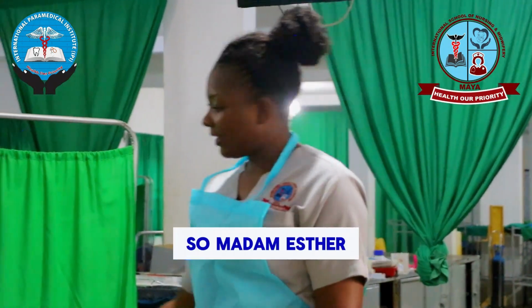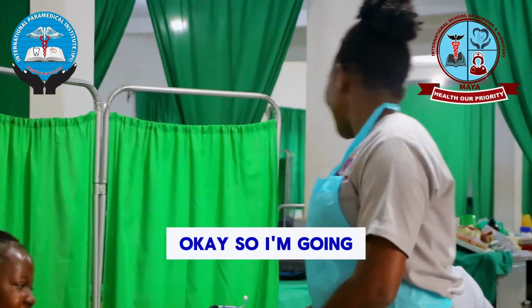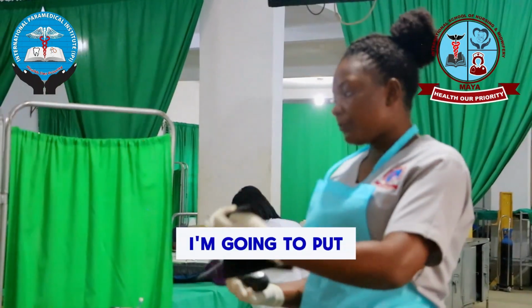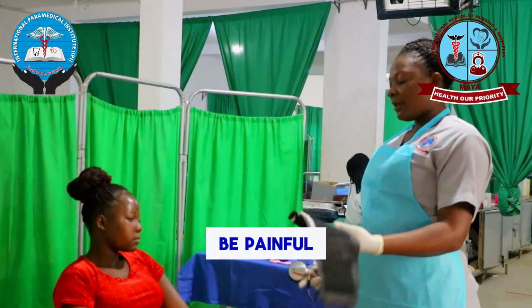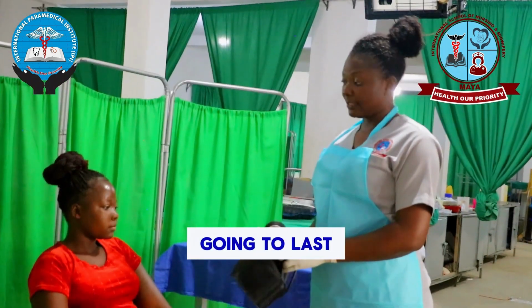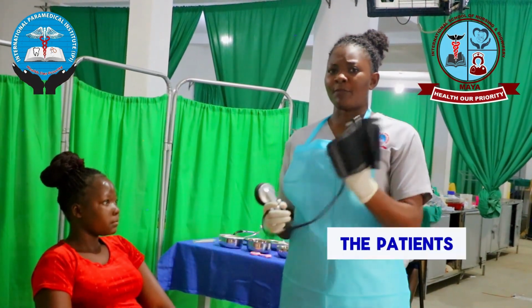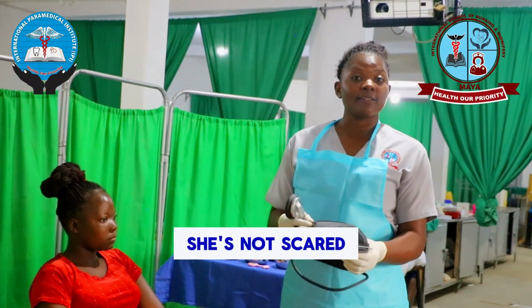So Madam Esther, how are you feeling? Are you scared? No. Okay. So I'm going to take your blood pressure. I'm going to put this cuff onto your hand. It's not going to be painful, but meanwhile I'm inflating, you might feel some pain, but it's not going to last. So you explain the effect of this cuff to the patient so that when the pain comes, she's not scared.